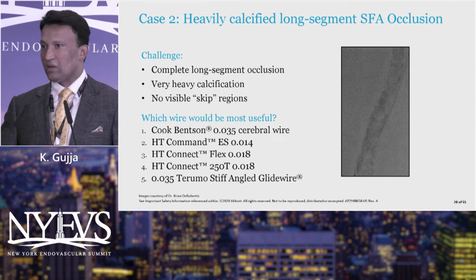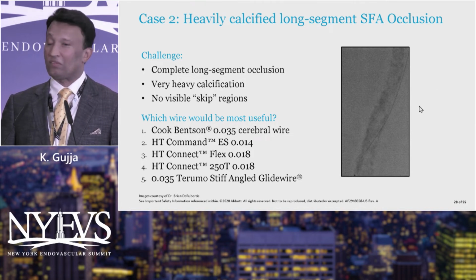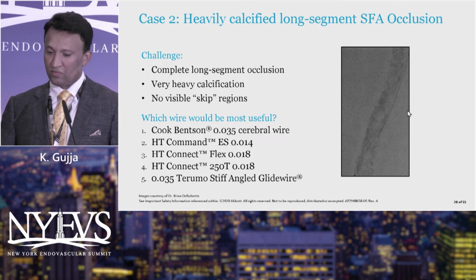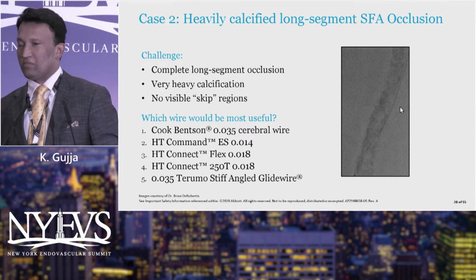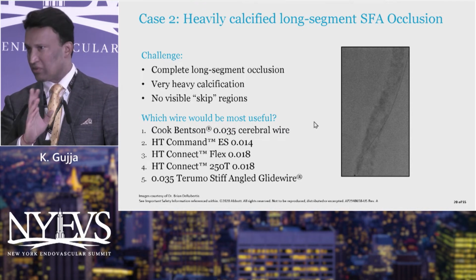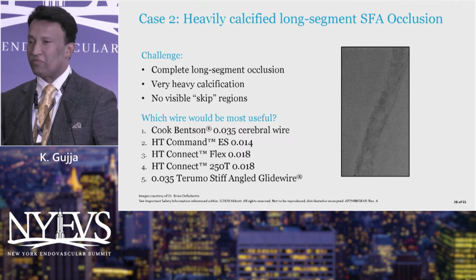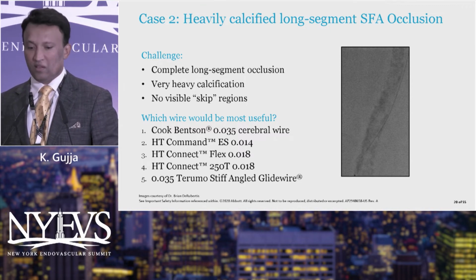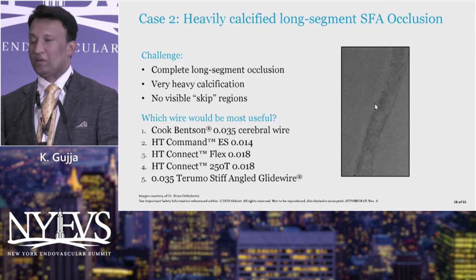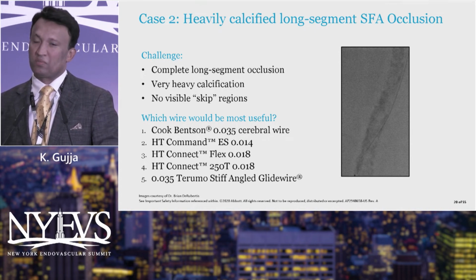Again, calcification, right? Achilles heel for our endovascular space. Nobody knows what to do with it yet. Again, a lot of data to come in. Especially how to cross it. Everybody has a style of crossing it. Some people directly go to an O35 wire to start with. I think Dr. Purushottam probably goes with an O35 wire. Dr. Krishnan tries with an O18 or an O14 first. Everybody has their style. So what is right, what is wrong, it depends on your style. So I always try, if it's very calcified and it's a CTO, I directly go to an O35. I don't even waste time with an O18 or an O14 system.